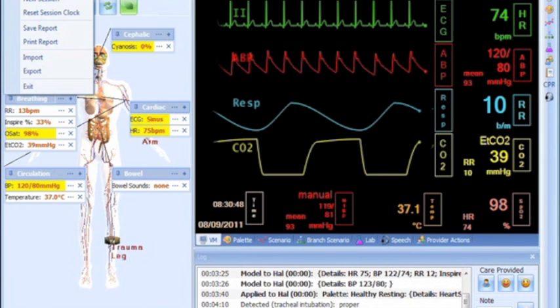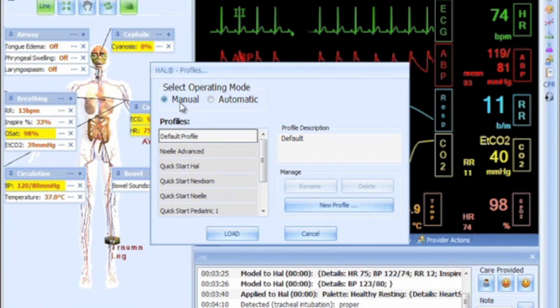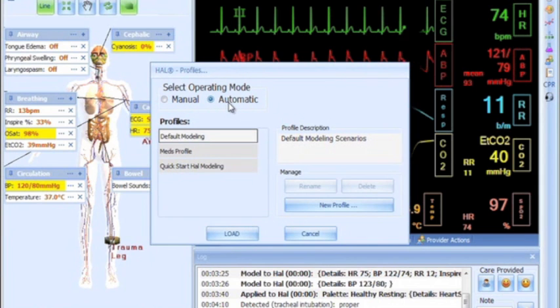GIGA can be used in two different ways. Manual mode: In this mode, vital signs and other responses are changed according to the specifications given by the instructor.